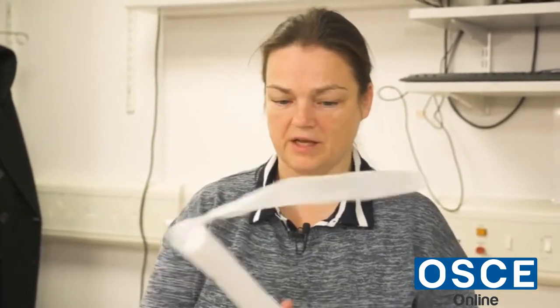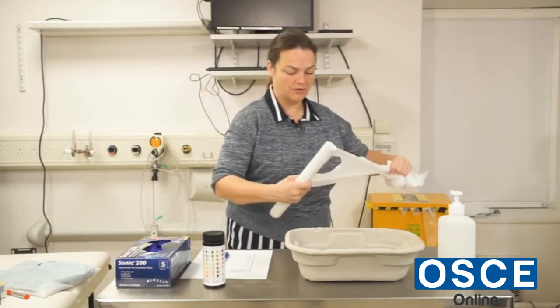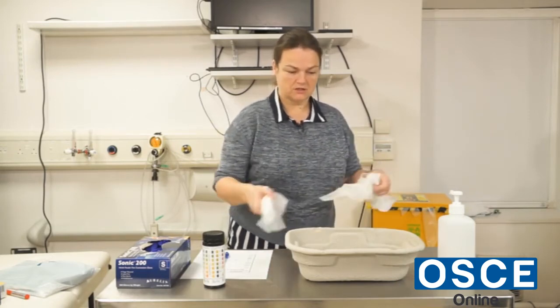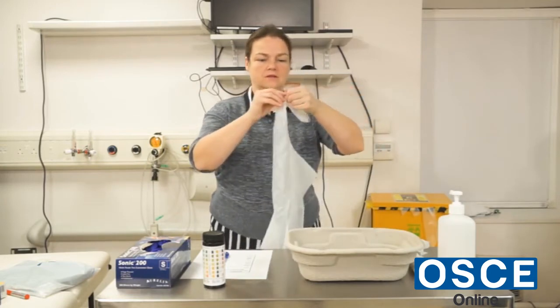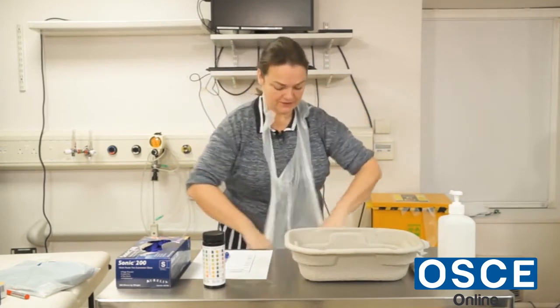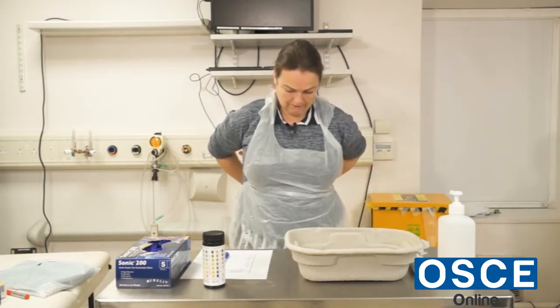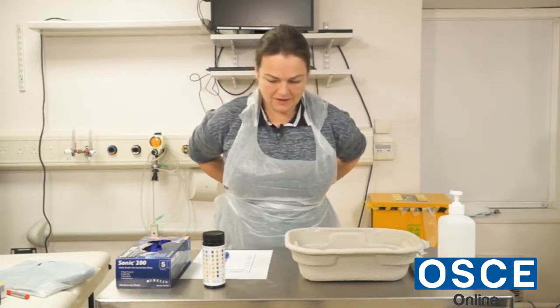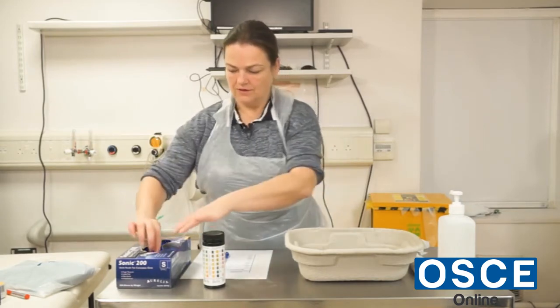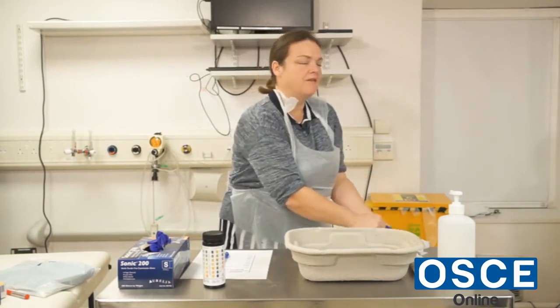I'd need a pen to write the results, some gloves and an apron. So I'll put my apron on. I've also got a disposable tray to run the urine test in. So I'm going to don the apron, and get some gloves on, and ask Sarah for the sample back.